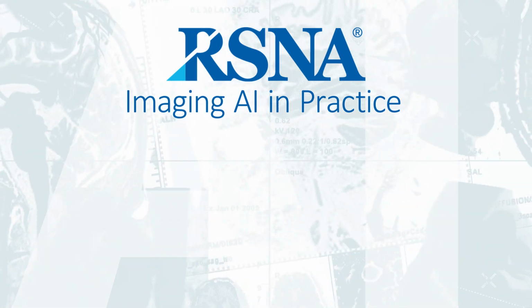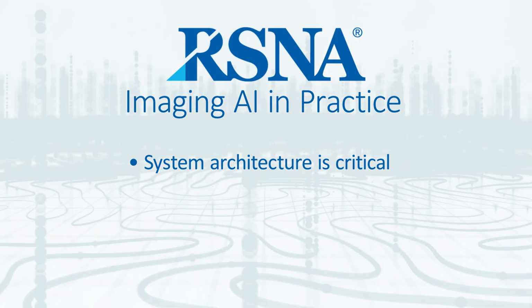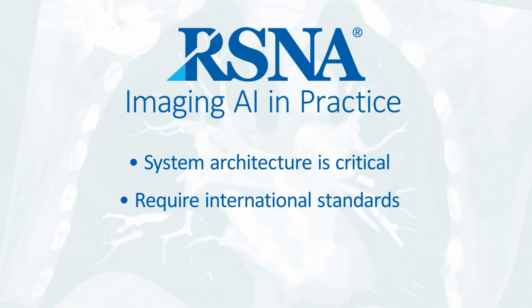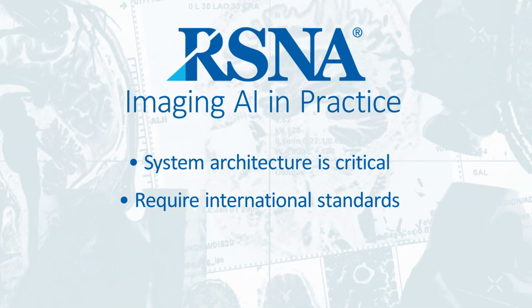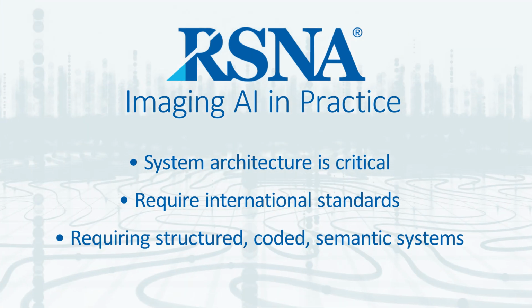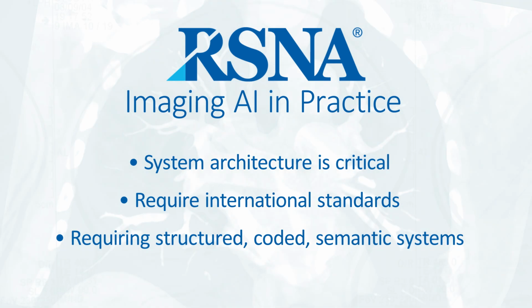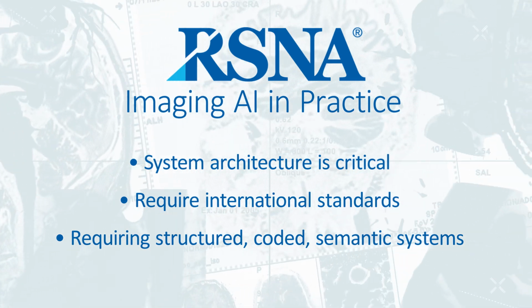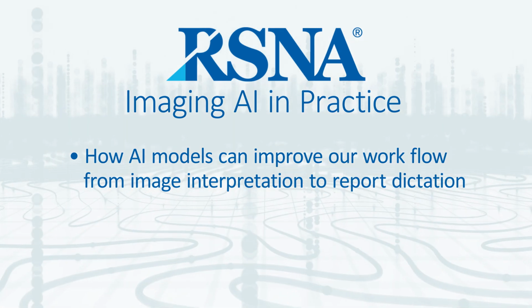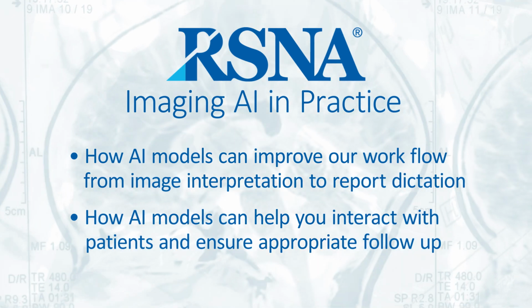In conclusion, we hope that you consider the following takeaways. The architecture of the overall system for your hospital is critical, requiring international standards such as IHE, DICOM, HL7, and FHIR enables interoperability. Requiring structured, coded semantic systems such as RADLEX, LOINC, and SNOMED will make the AI and other data flow through the system. Some benefits shown in this demo include how AI models can improve our workflow from image interpretation to report dictation, and how AI models can help you interact with patients and ensure appropriate follow-up.